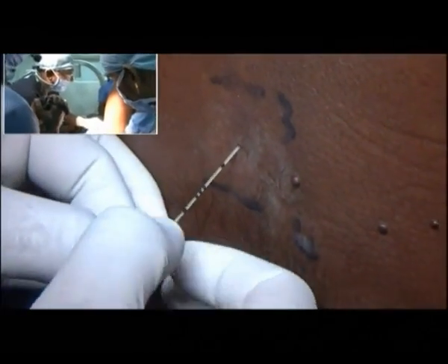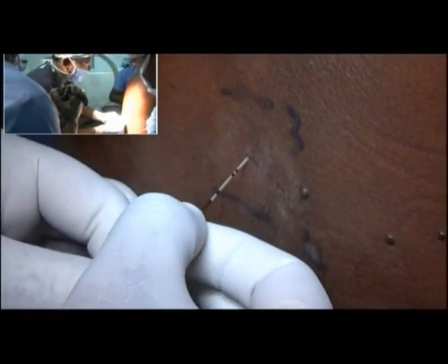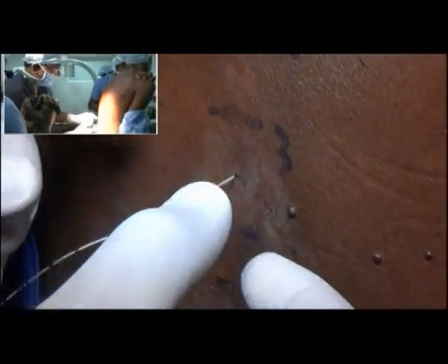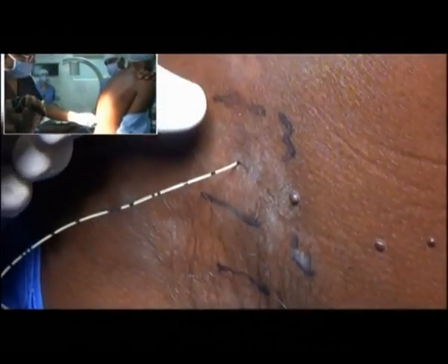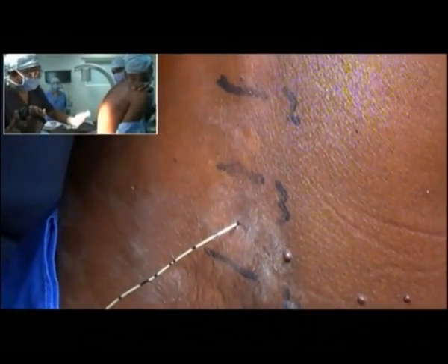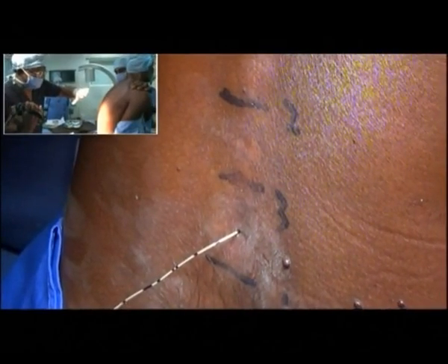15, 20. 9, 8, 7. So we fixed it at 7 centimeters now. Roughly say about 3 to 3.5 centimeters from here to L2. So the catheter's tip is roughly at the level of L2. And we assume that the drug is going to spread equally on either side of the catheter tip.